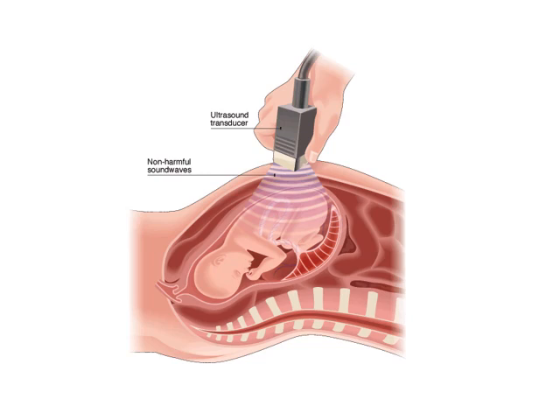Okay, so basically what's happening here is the transducer here, and there's a pile of different types of transducers as well. I'm just showing you this picture here, but there's wider ones or skinnier ones. So you'll see a whole variety of transducers if you end up going into ultrasound technician or becoming a radiologist. This is going to be emitting the sound waves. The sound waves are going to go through here, and it's going to bounce off different parts of the baby's body depending on the type of tissue. And so the sound waves are going to bounce back. The information is going to go into the computer, and the computer is going to calculate and make the picture from that.